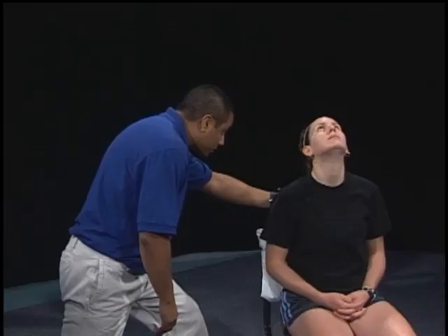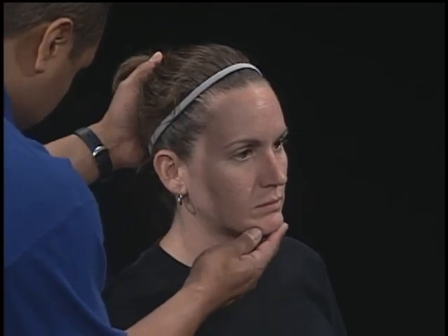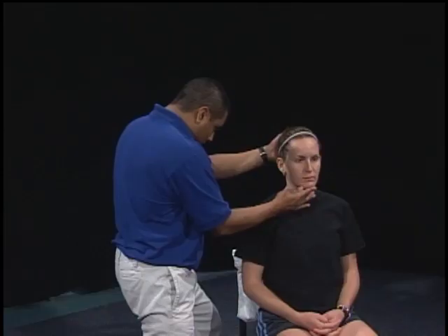Assess the trunk for extension of the thoracic and lumbar spine. Usually, stabilization is achieved through patient cooperation and support from the back of the chair. Put one hand on the back of the subject's head and with the other hand hold the subject's chin. Push gently but firmly upward and posteriorly on the chin to move the head through range of motion in extension. Observe the trunk to prevent extension of the thoracic and lumbar spine.